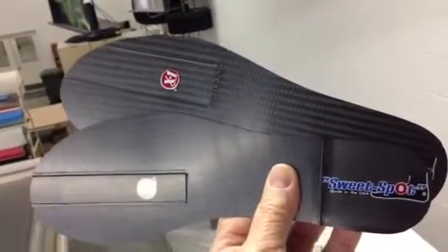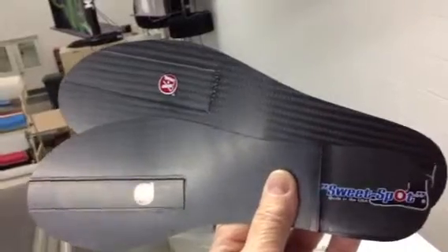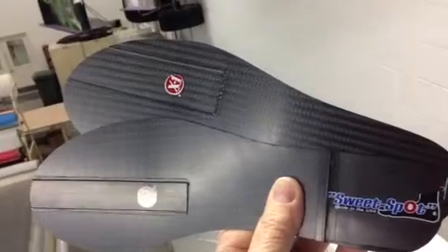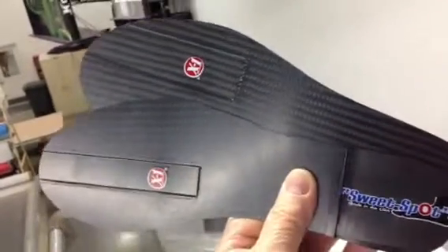Hi, this is Clyde at indianabrace.com. We've got two new products for Neuroma. The one on the right is for third and fourth Neuroma, and the one on the left is for second and third.